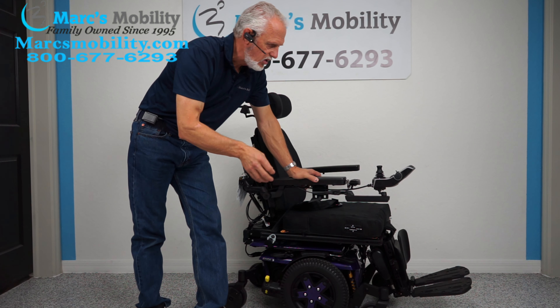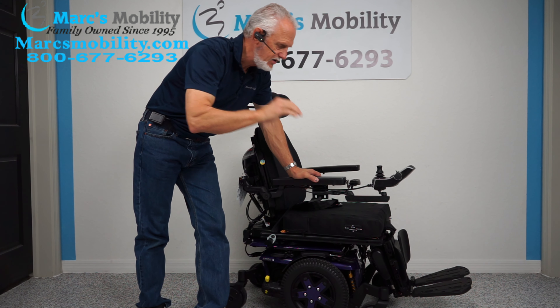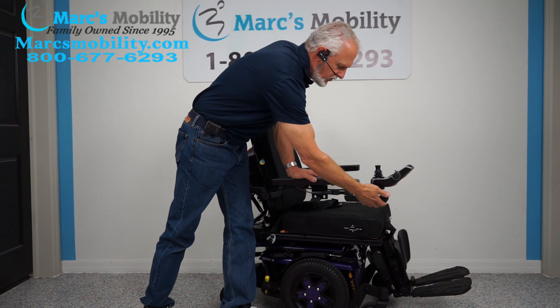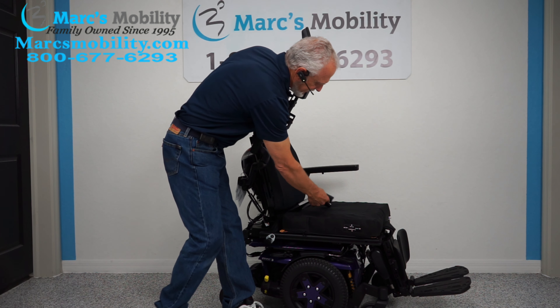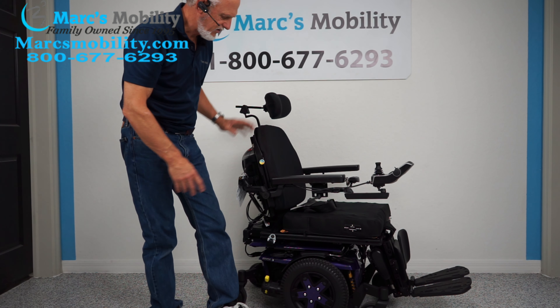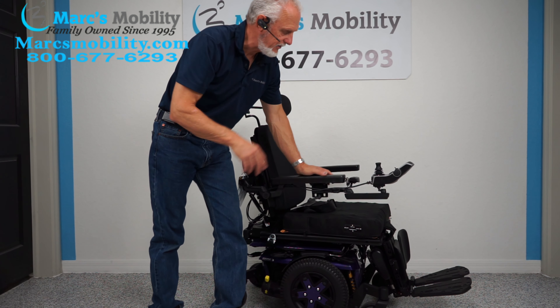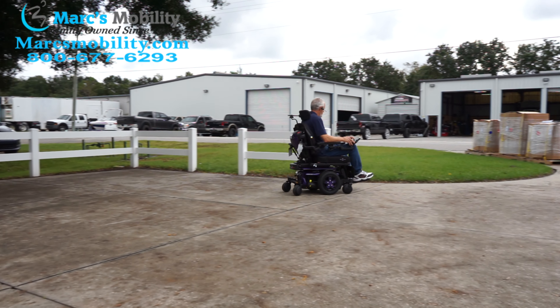Let's recap. We have here a Quantum Edge 3 power chair — the latest in technology — with 3 miles on it. It has the 12-inch seat lift, the electric tilt, the electric recline, the electric feet, the swing away joystick, the flip-up arms, the air cushion, the safety belt, the lighting kit from the factory, the adjustable headrest, and the suspension we talked about earlier. This is just a nice power chair with 3 miles.